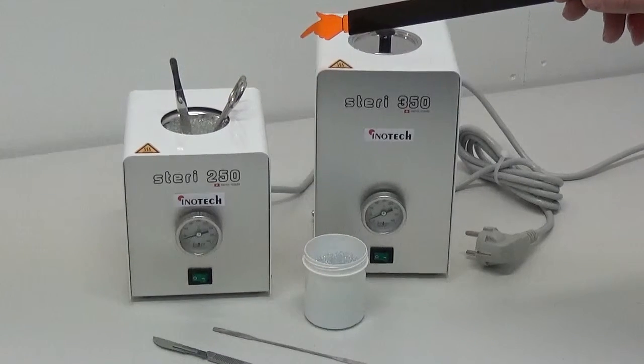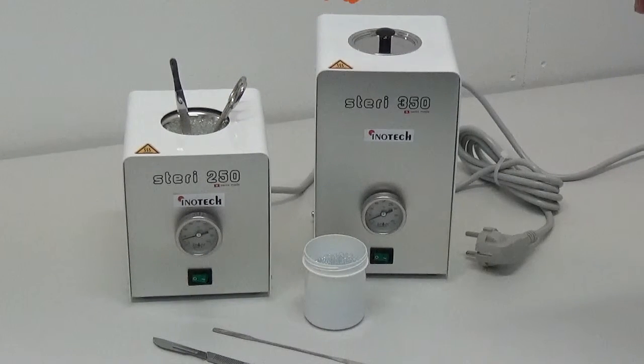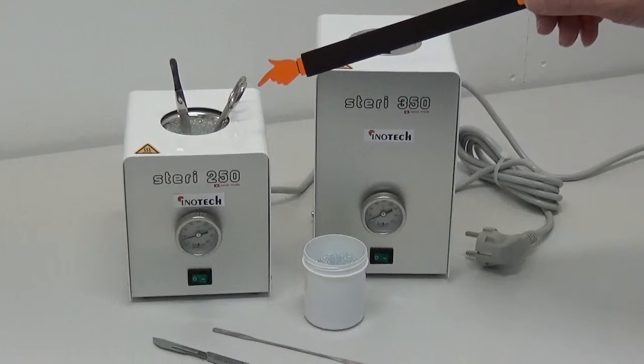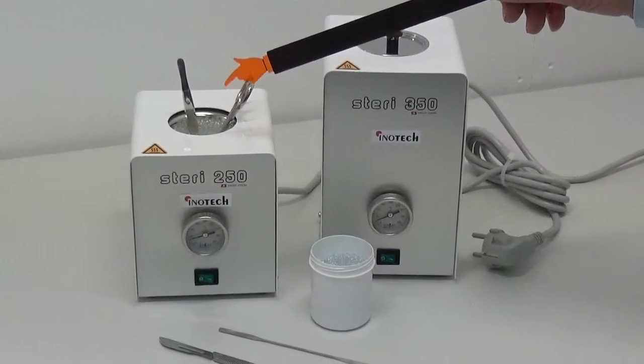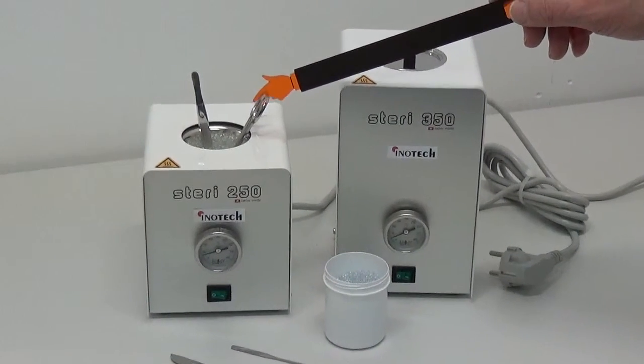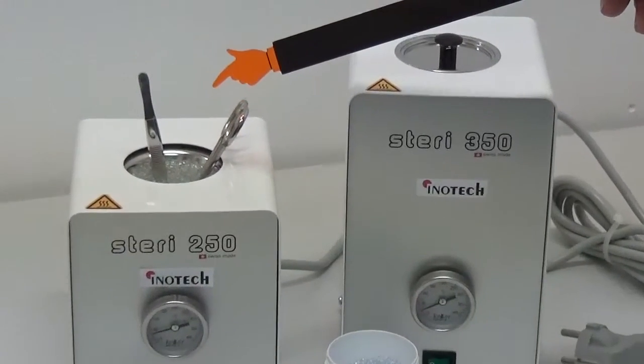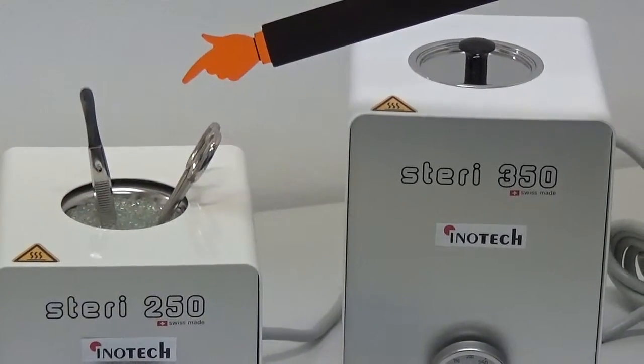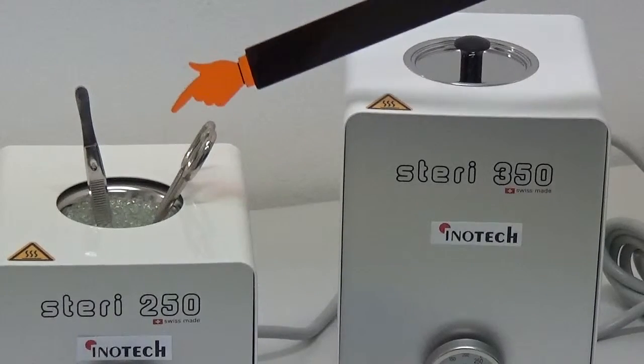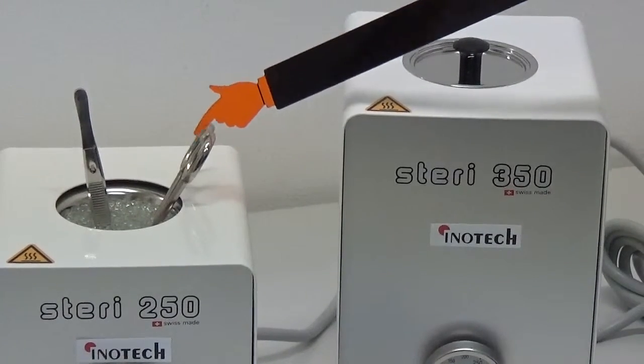250 degree glass beads will completely destroy within 10 to 15 seconds microbes and spores on the surface of metal or glass instruments.